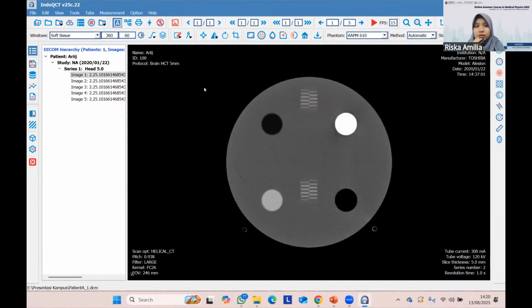There is another question from the Zoom chat from Mr. Ahmed. Although you open the same image with different ID information, should not two phantom images but having different IDs appear in comparison? Yeah, thank you very much for the very nice question. Actually, in the DICOM info, there are so many UIDs, unique IDs. The patient has a UID, the study has a UID, the series also has a UID.